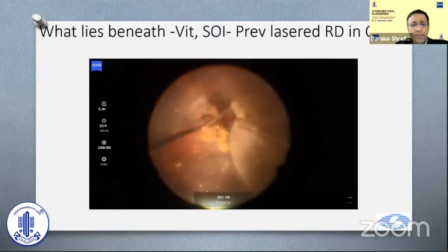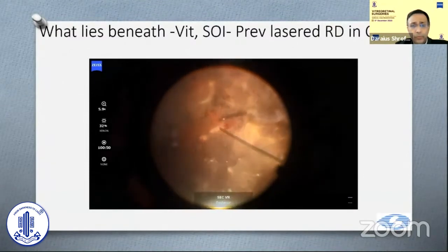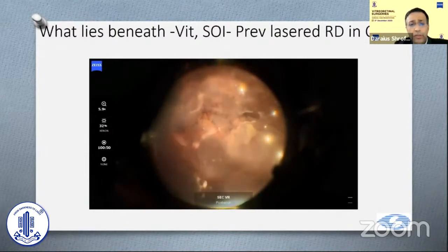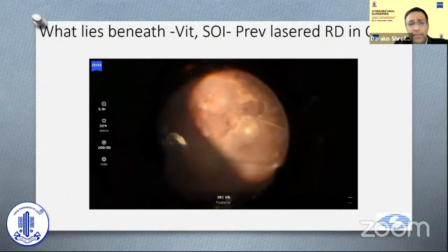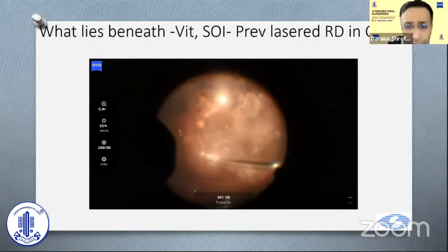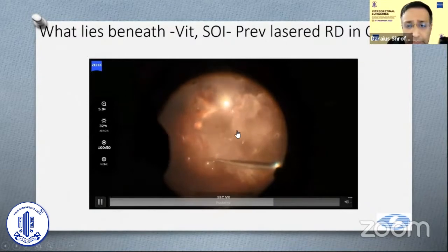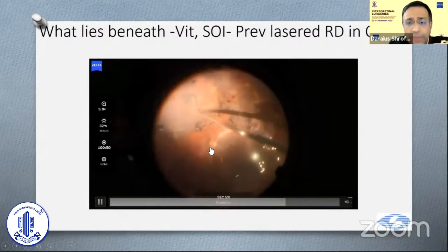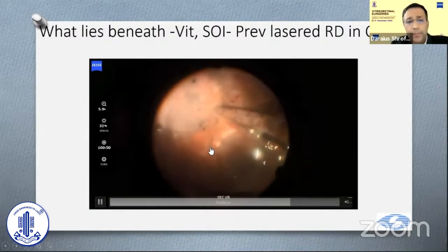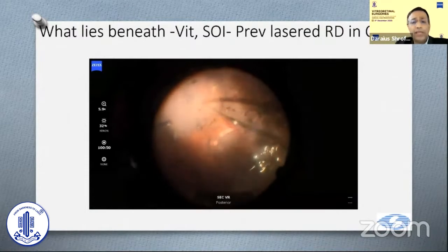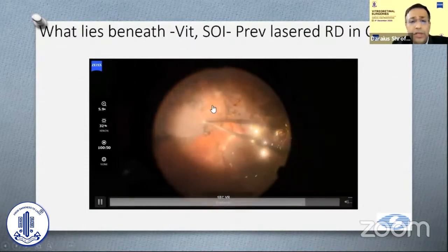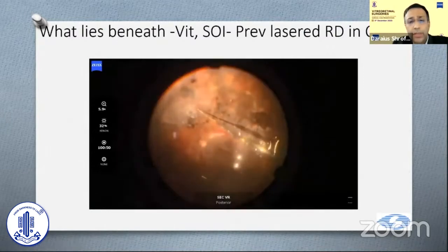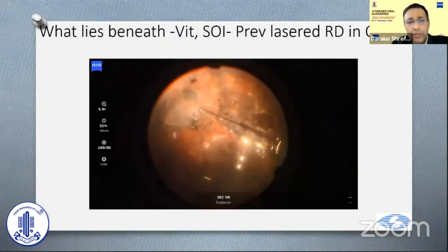You can see how nicely it is visualized with the system. This visualization allowed us to proceed, and at the time of fluid-air exchange you can see it taking place. The break is settled, but now look at the posterior pole — with the flute needle you can see these crystals migrating and being removed, helping clear all this material from the posterior pole. In the infero-nasal area there was a separate previously treated region that did not attach initially, so we made a separate small retinotomy, settled that area, and laser was performed.